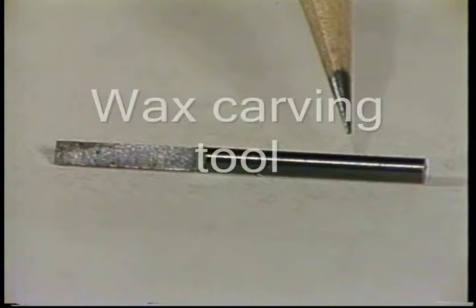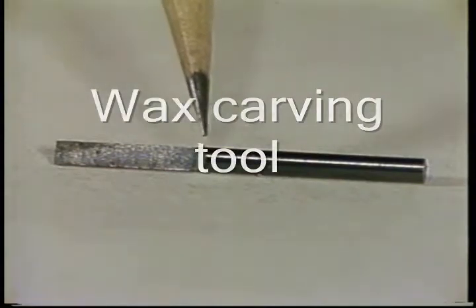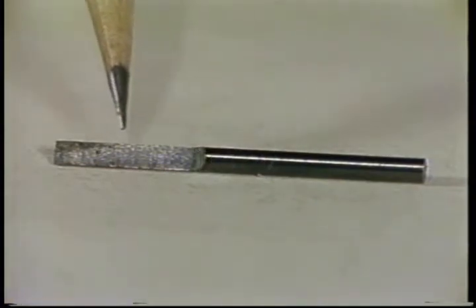The wax cutting tool is useful for carving wax for simulating tooth preparations.